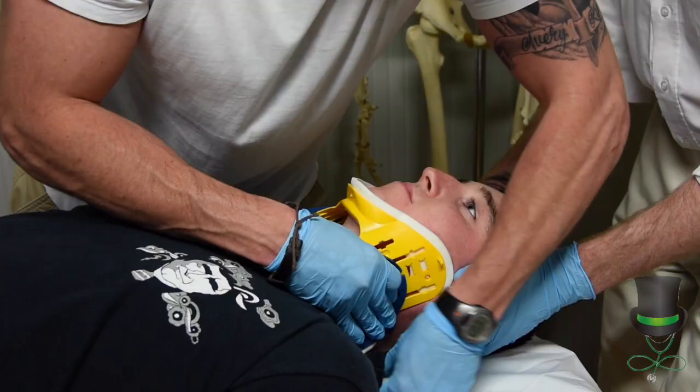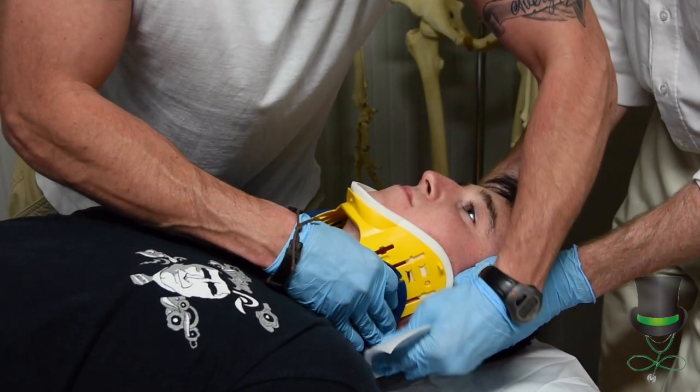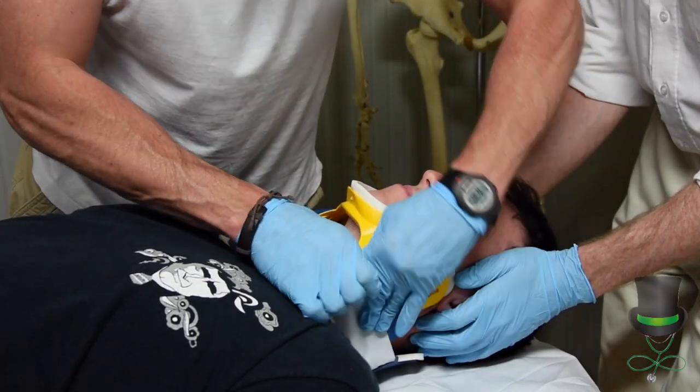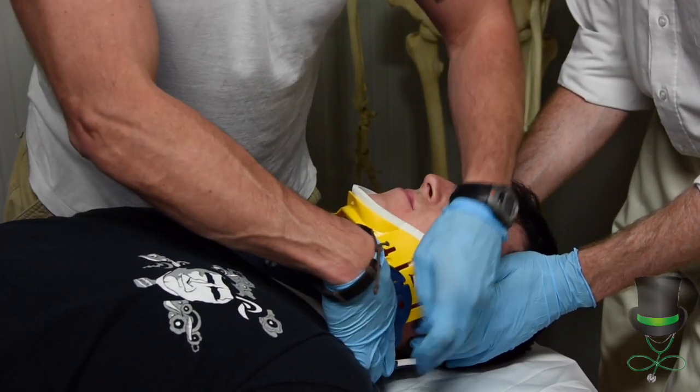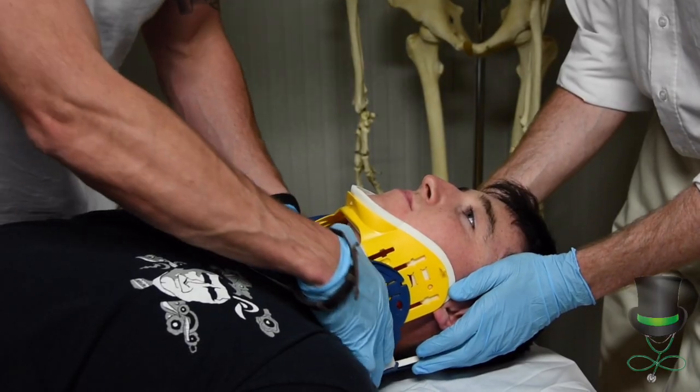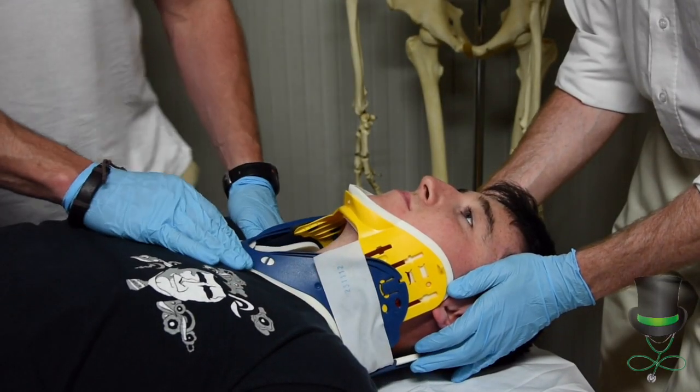When you're happy that it's in place, reach across, grab your velcro strap, and strap the collar in place. Reassure the patient at all times.